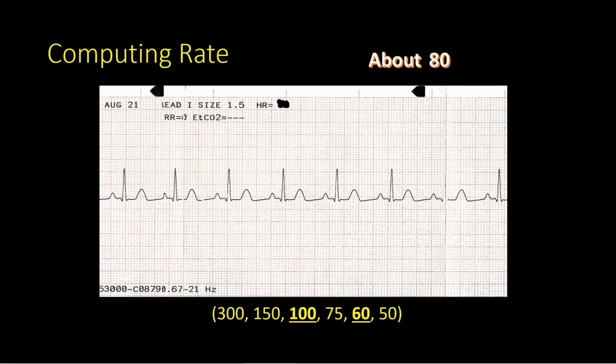Does that sound right? Yeah, I can buy in on that. And when we correlate it back to the monitor, which we blacked out up here, the printout tells us, yes, that's right, it's about 80 beats a minute. Again, two ways to do it. We can count how many complexes in a 6-second strip, times 10 would be 80, or we can do a countdown. Again, if we went from here, we'd say, okay, it's a little bit sooner than the 75 mark, so we'd call it 80.